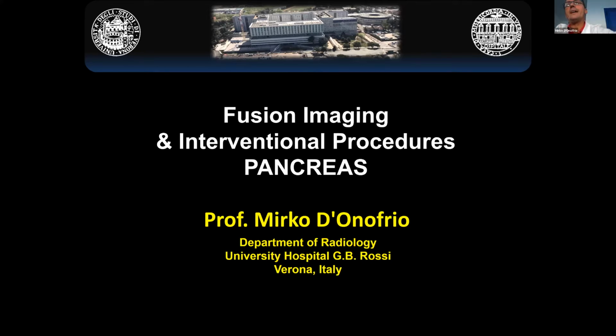So I designed this presentation speaking first about interventional procedures to the pancreas, obviously using ultrasound. This is an interesting point because we know that we have endoscopic ultrasound first for sure, but in radiology, I am a radiologist in radiological departments, normally the easy way or most used is CT.